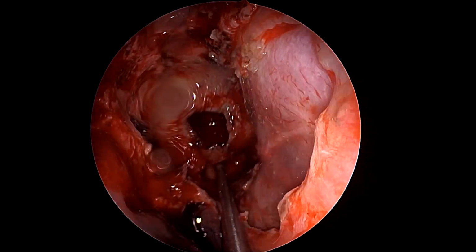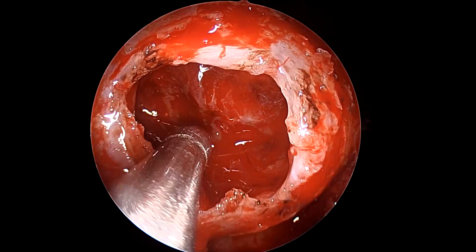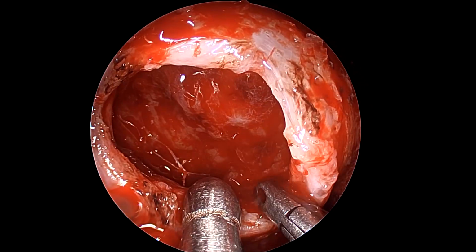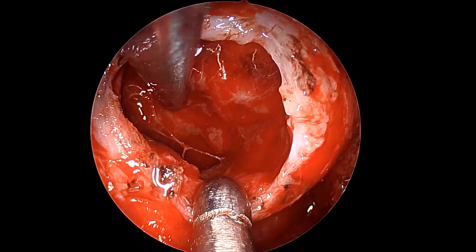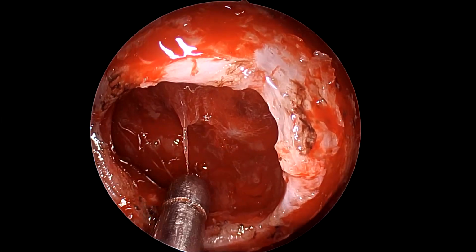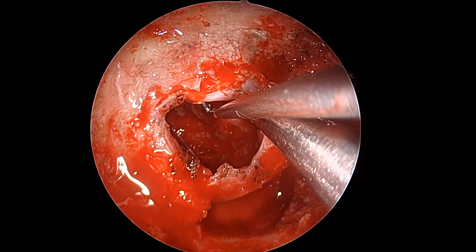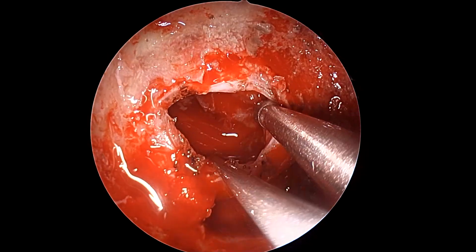It's always better for the assistant or someone who's there with you in the surgery to keep irrigating at the time when you see some fogging, and not remove the scope each time, because each time you remove the scope and put it back, it can again fog, and that ends up using a lot of time. So it's better that the moment there is some fogging in the scope, there should be a prompt, gentle irrigation to clean the scope and optics, for the surgery to maintain continuity without any stopping in between.